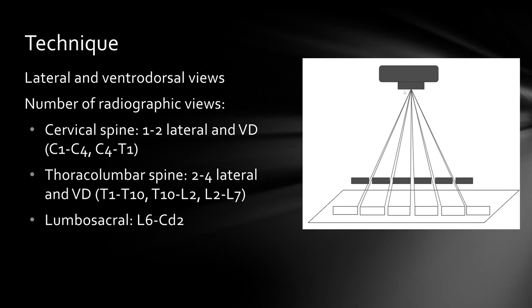The reason that you want to collimate to the area of interest and take several successive radiographs is that there is beam divergence just naturally. This is our X-ray tube. The plate or film is under the patient. This is the patient's spine with the vertebrae.